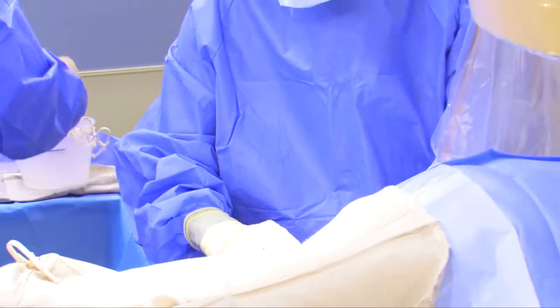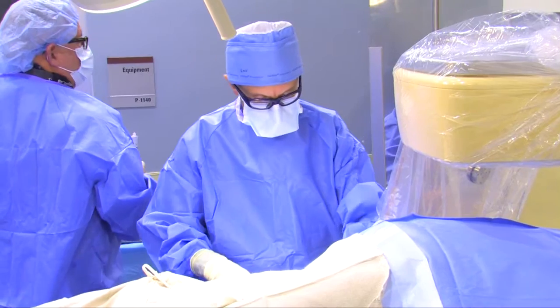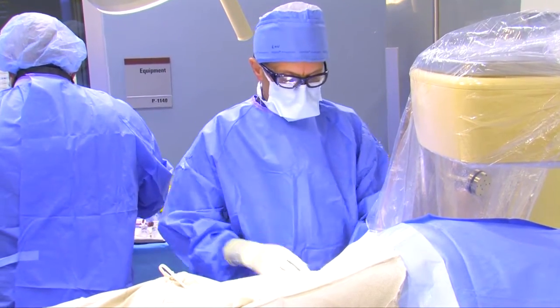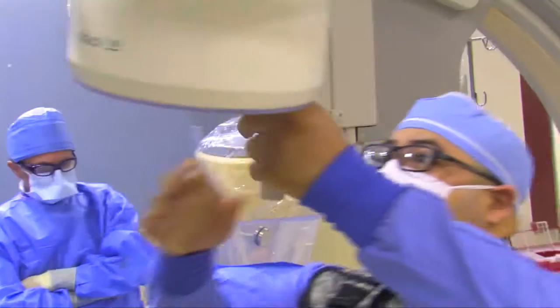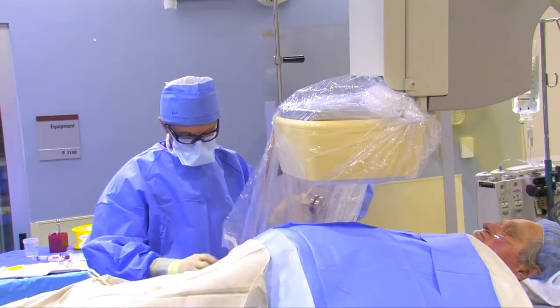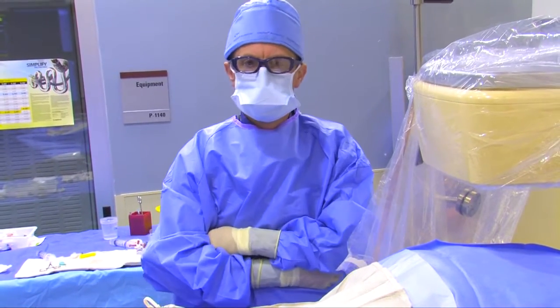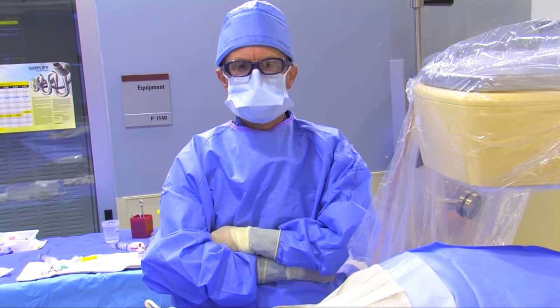The next thing is we will get a long wire, and over that wire we will pass the catheter that's going to engage the coronary artery. The wire is the pathfinder, and the catheter tracks over the wire. We do all these procedures using x-ray, and we inject a liquid that has iodine in it — a special dye — and the iodine we can see under x-ray, which shows us the inner channel of the artery.